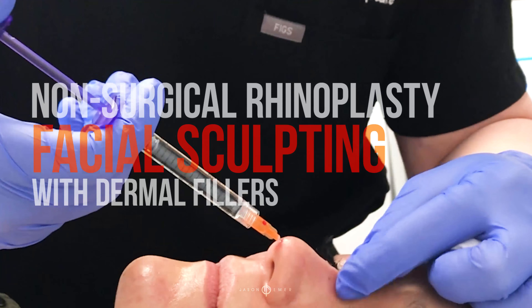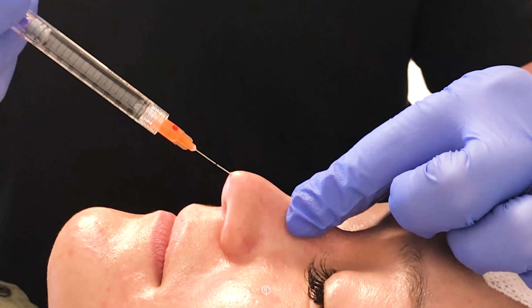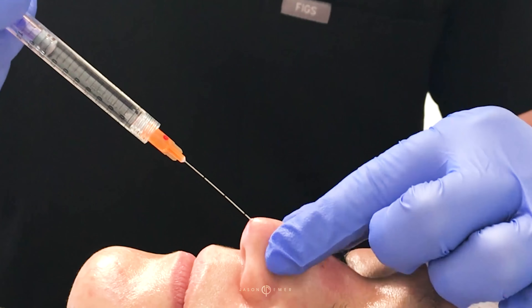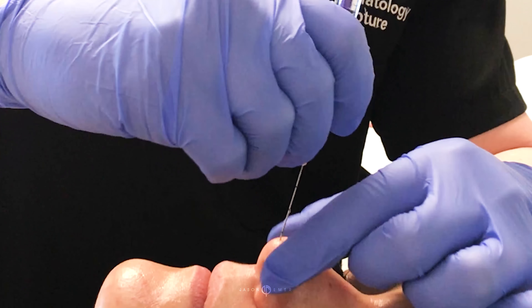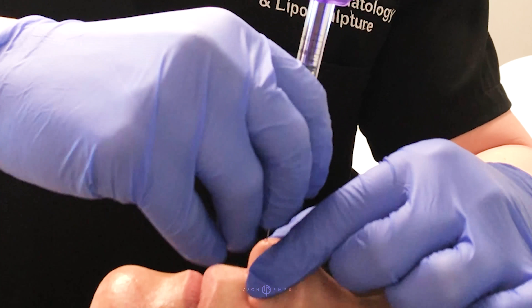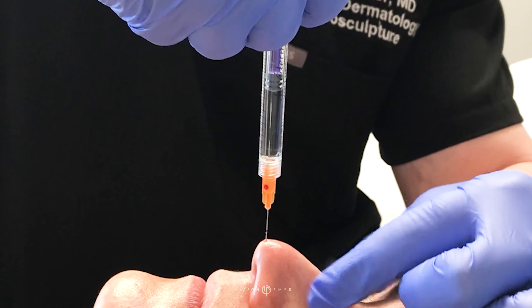We're using the cannula all the way up under the muscle, just giving a little volume up on the bridge and you can see elevation here. Not too much — she just wants the illusion of it being a little straighter.